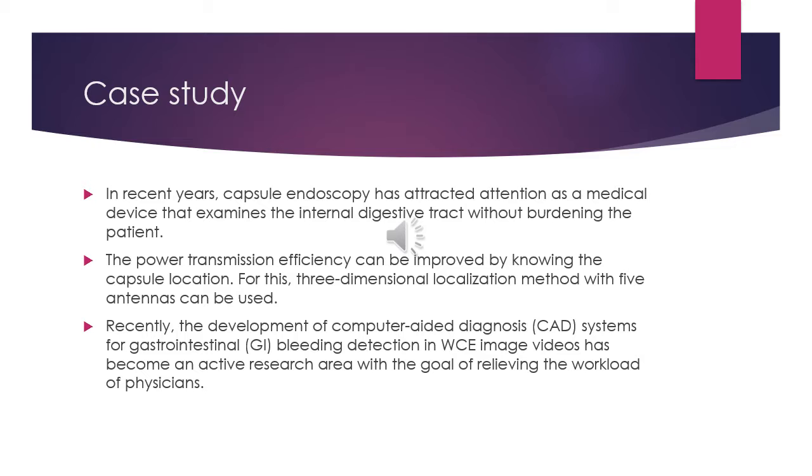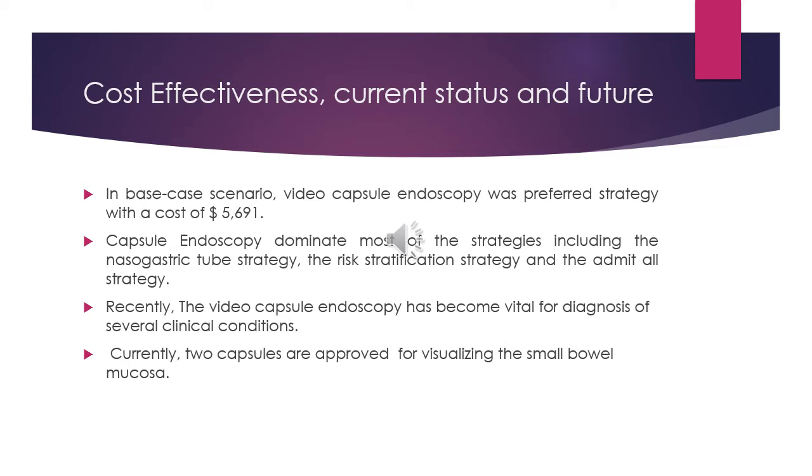Recently, the development of computer-aided diagnosis systems for gastrointestinal bleeding detection in image videos has become an active research area with the goal of relieving the workload of physicians.